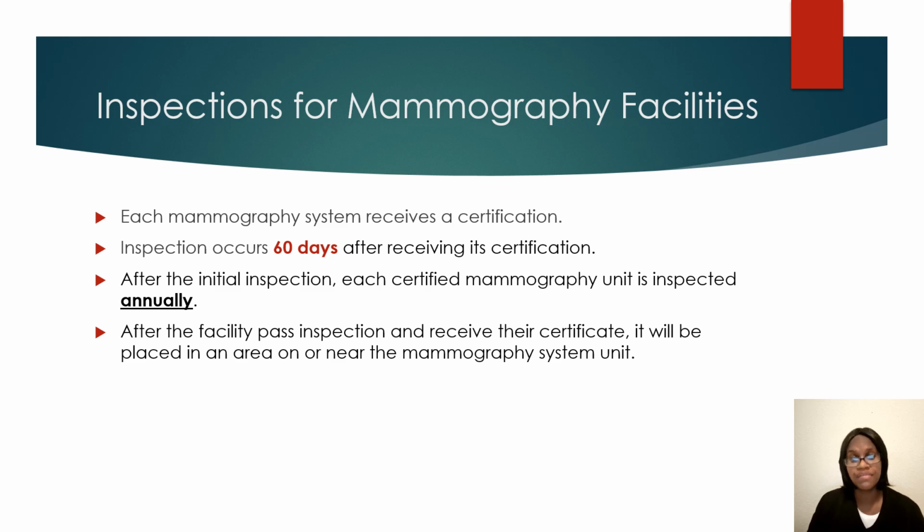Inspections for your mammography facilities. So, mammography facilities do have to have inspections done. Each mammography system receives a certification. Inspection occurs 60 days after receiving its certification. After the initial inspection, each certified mammo unit is inspected annually.